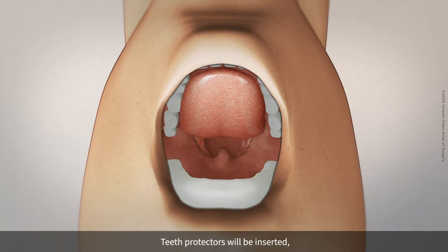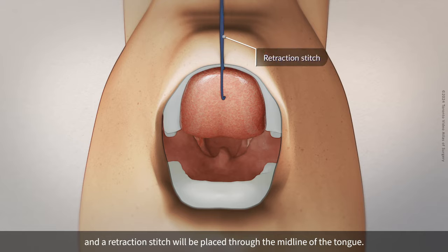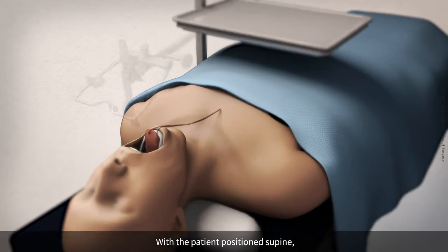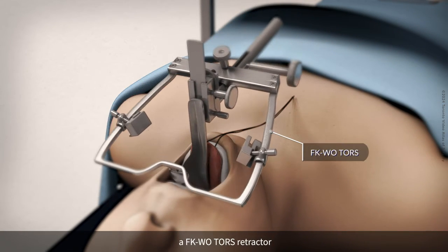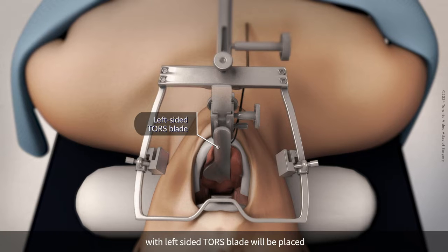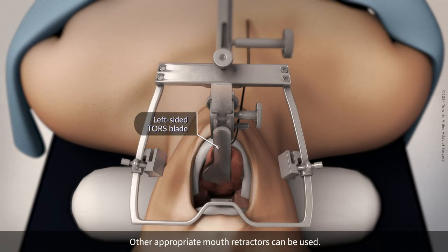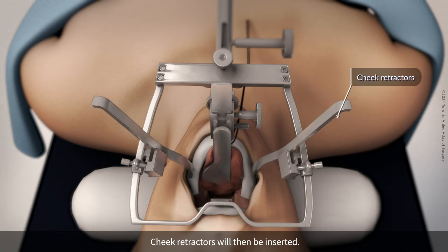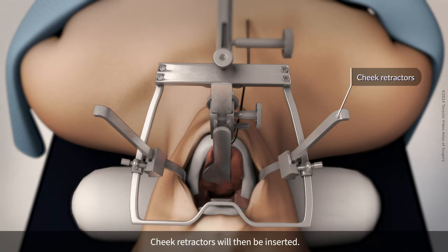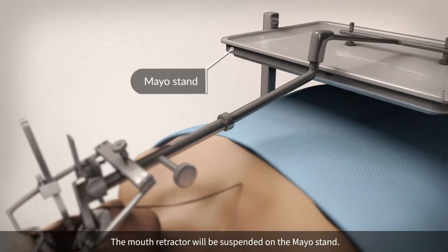Teeth protectors will be inserted and a retraction stitch will be placed through the midline of the tongue. With the patient positioned supine, a FKWO TORS retractor with a left-sided TORS blade will be placed to expose the base of the tongue. Other appropriate mouth retractors can be used. Cheek retractors will then be inserted, and the mouth retractor will be suspended on the Mayo stand.